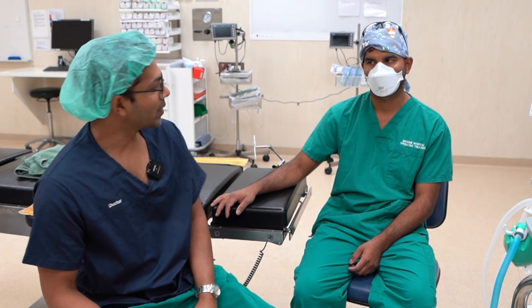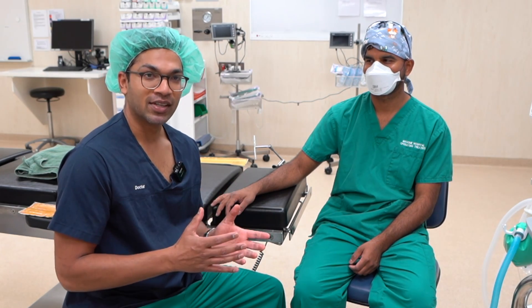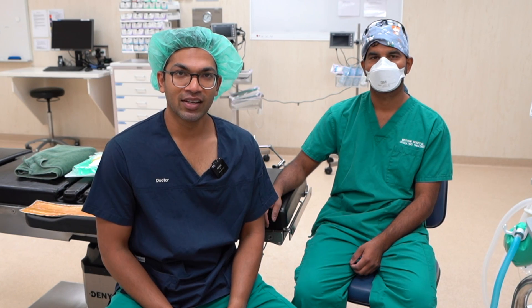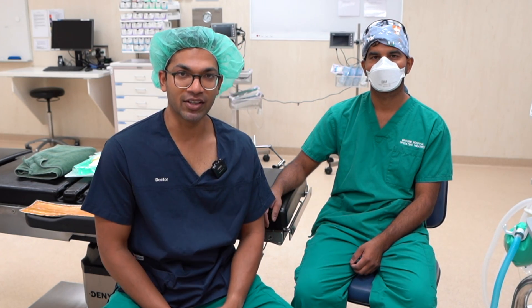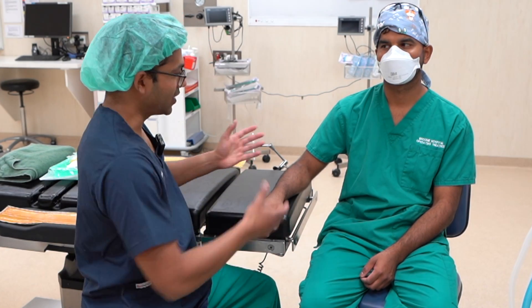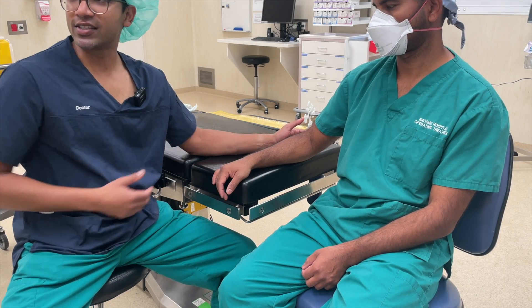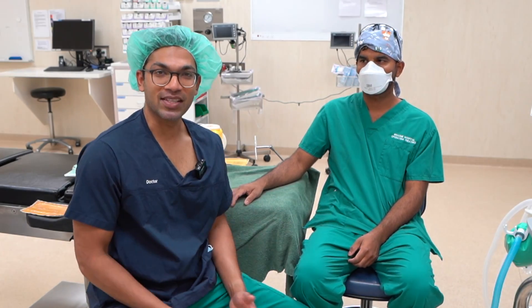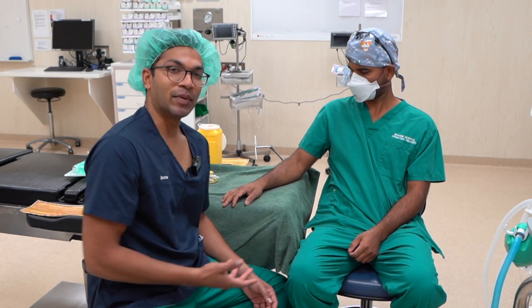We're going to do a demonstration. To start off, make sure you get consent from your patient, clarify the indication, and use a rigorous aseptic non-touch technique — I've gone through that in other videos. Next, make sure you've got the ergonomics right and position your patient well — sitting or lying comfortably — and that you've got the right ergonomics for inserting the cannula. In terms of setup, make sure you've got a sharps bin handy and gloves.